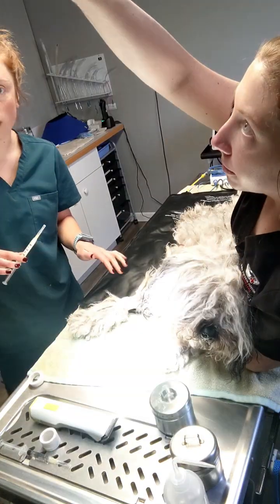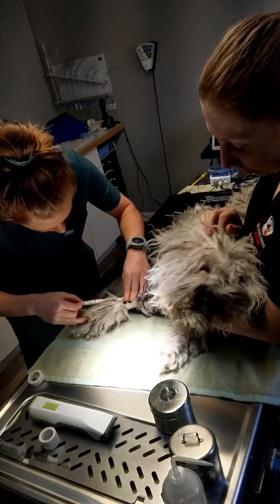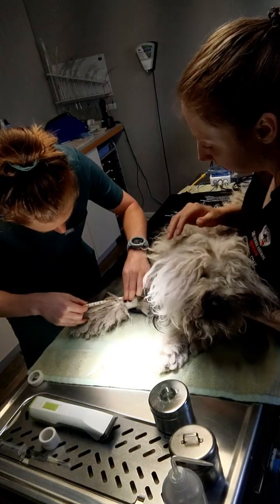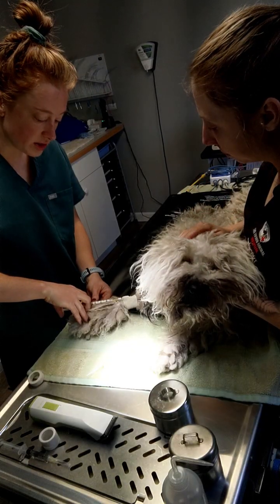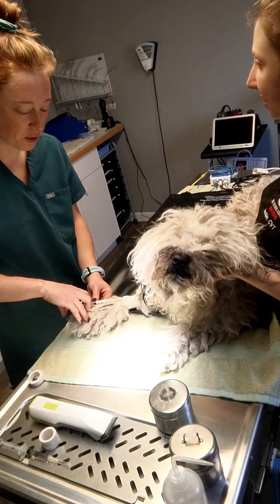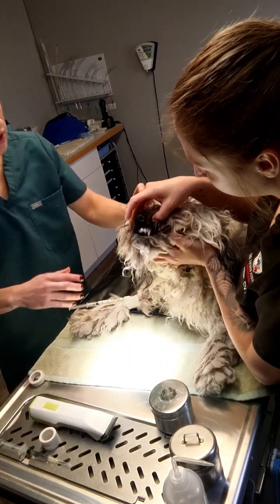So we'll just put propofol directly into the catheter. And I want to push it not all at once, fairly slowly. And we'll be monitoring for the depth of the induction just based on vital signs.